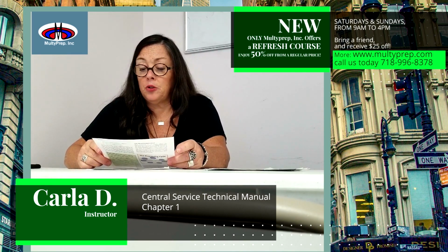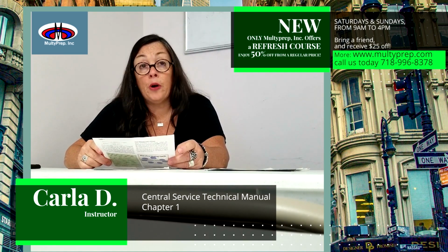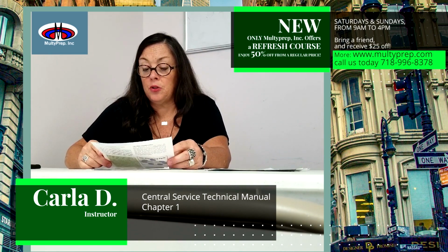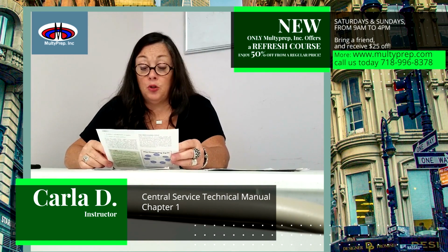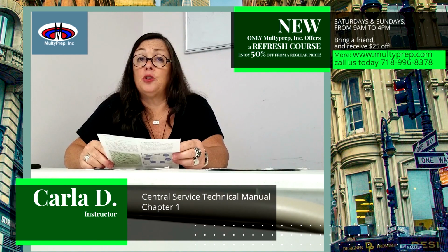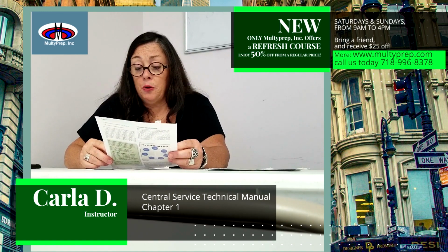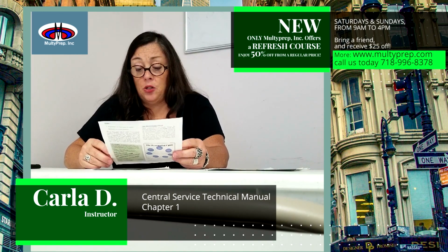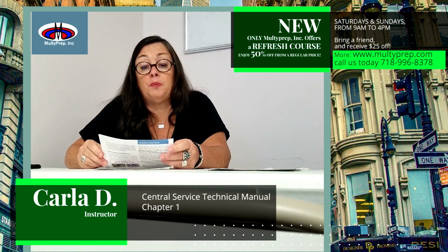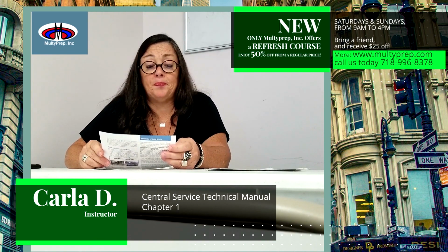Personnel working in the sterile storage area must have thorough knowledge of every item, how it is used, where it is located, and the process for obtaining it. Other knowledge and skills include those needed for inventory control and supply distribution, surgical specialties and procedures, sterile storage and handling requirements, computer systems relating to inventory and case carts, acquisition and disposition of supplies, and resolution of supply problems.